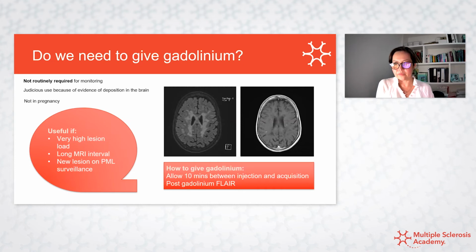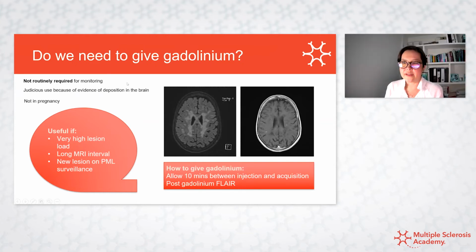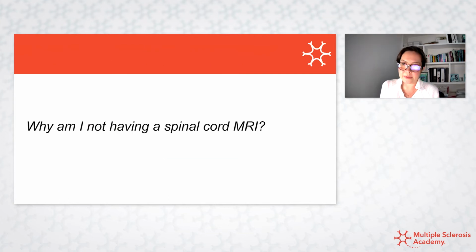In the next session, we're going to talk about Kesimpta, which might reduce the risk of a GAD enhancing lesion by 98% versus an active comparator. And so we'd have to scan hundreds of patients to find a new lesion if we just do this for everyone. Would that be right, Audrey? Yeah. So the yield will be pretty low. So the expense, the time, all of that adds up.